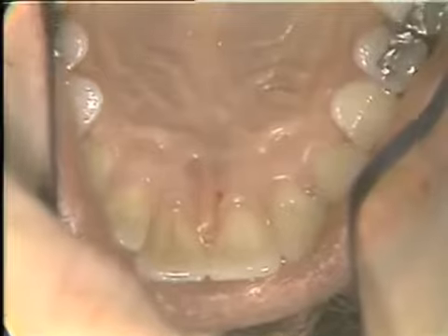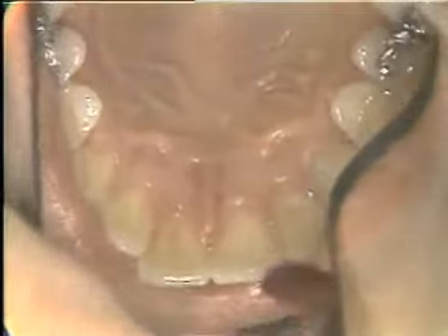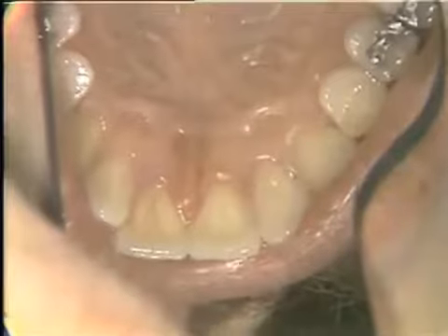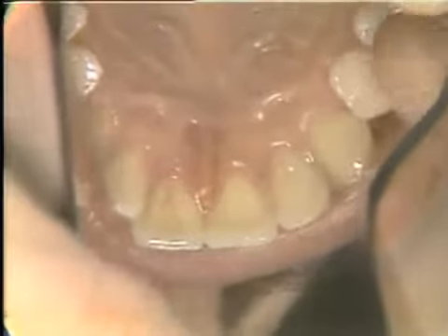We'll dry our mucosa and apply a little betadine again. And we'll make our injection just on this side of the papillae. It doesn't matter whether you make it on the right or the left, but one or the other. Don't inject directly into it.